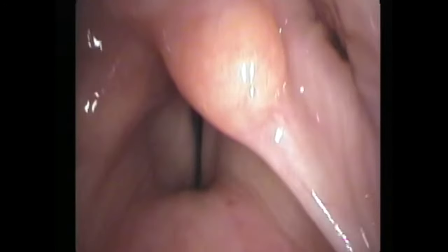And when we slow our video recording down, we gain a perspective on how much compensation is actually coming from the right side - the right vocal process is actually pushing past the midline. Here we have three images at high, medium, and low pitch. In the leftmost image, the right vocal process is near the midline, and the left vocal process is canted laterally.